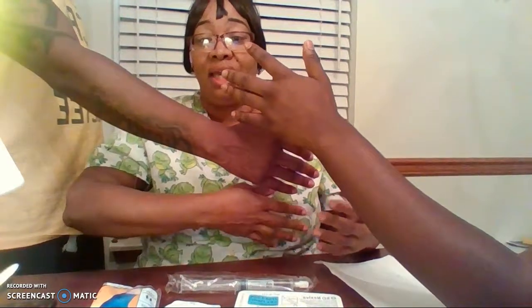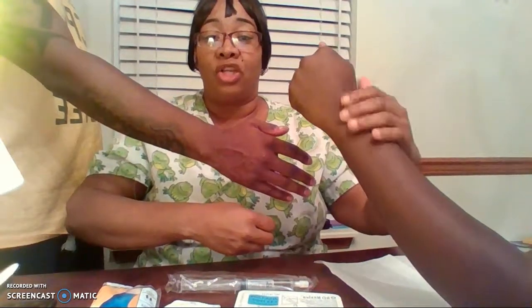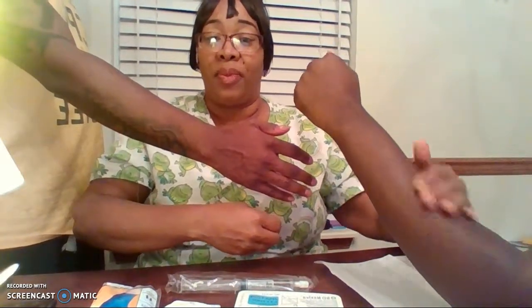So for instance, if the patient is covered in tattoos, it may be harder to see the veins. If they are a darker or a lighter skin tone, then it's harder to see the veins through the skin. Some of the patients are more muscular or obese, and so it's harder to feel the veins on the patient because there's more adipose tissue.